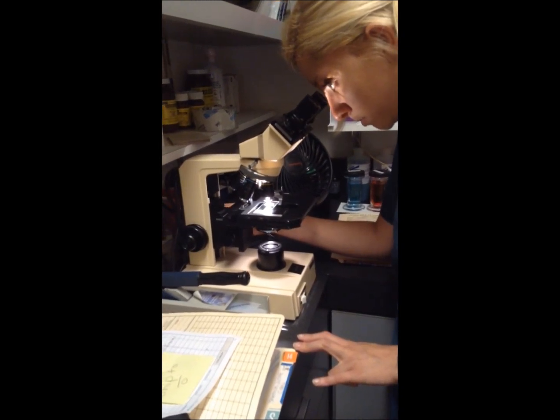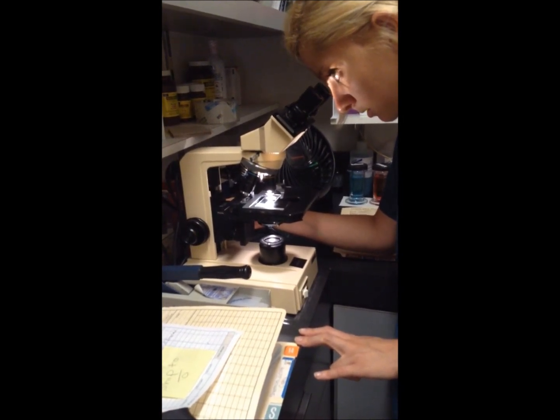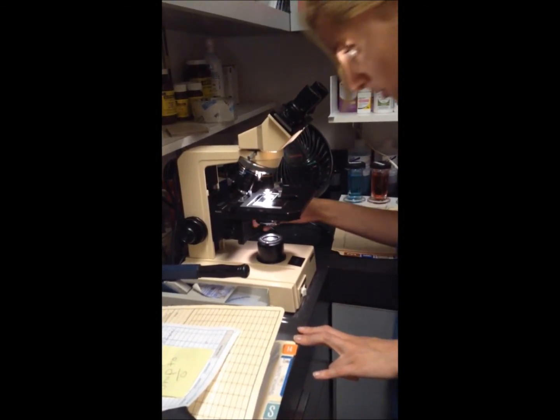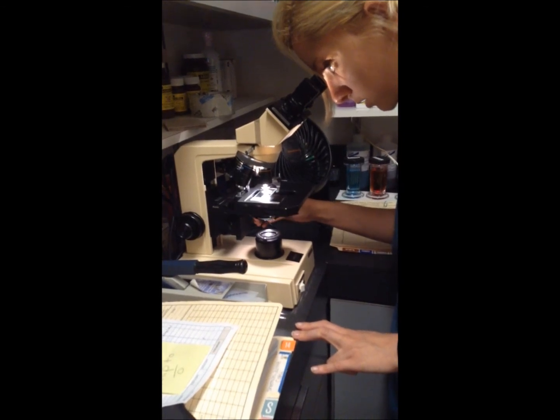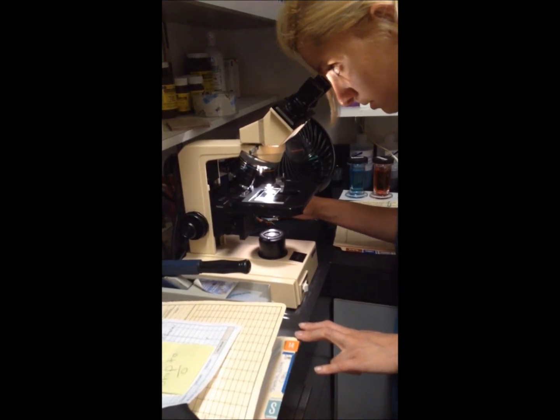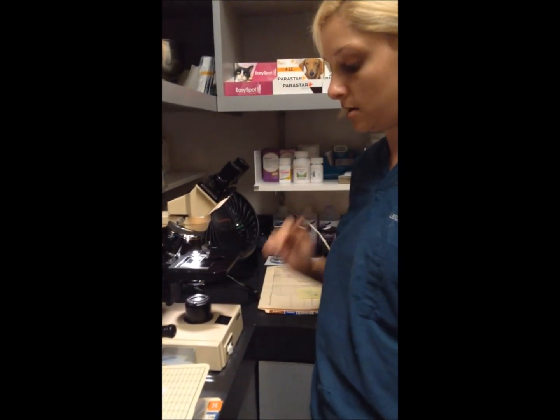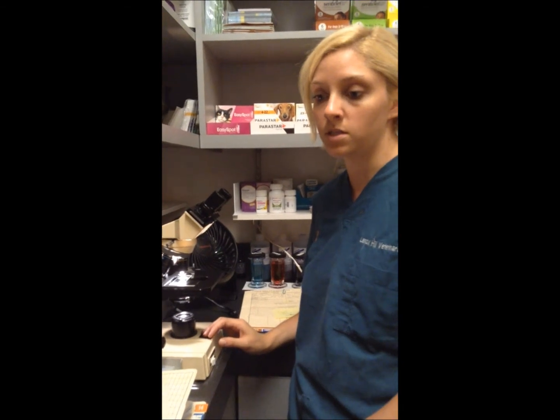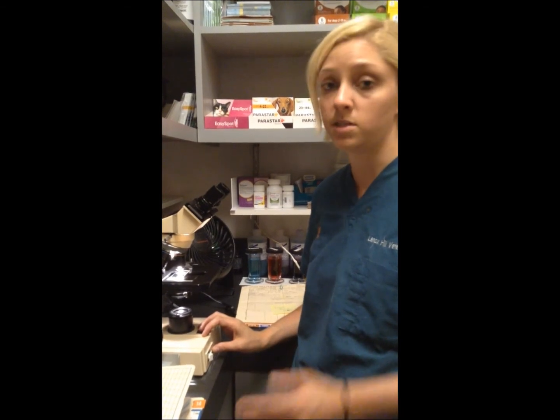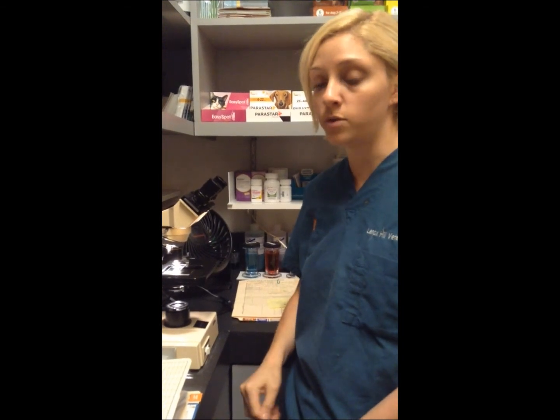So he's been pretty itchy, he's licking a lot, and we're not totally sure what's going on with him, but I'm in the 100th power now looking, and it doesn't really look like he has any mites of any sort. We previously did a cytology on him, and we saw some mast cells and some eosinophils, so we're thinking he might have some sort of an allergic reaction to either, he's on insulin, he just was started on the new insulin, so potentially that, or a food allergy of some sort.